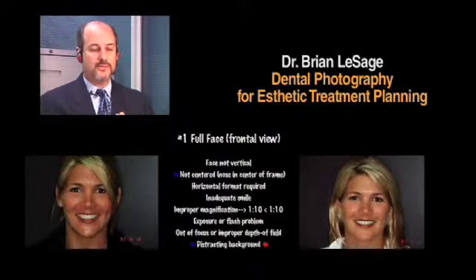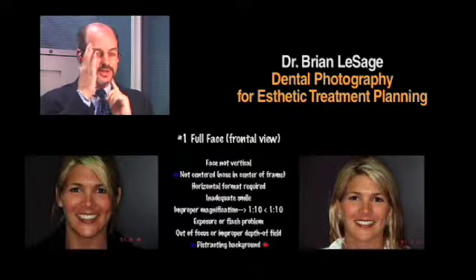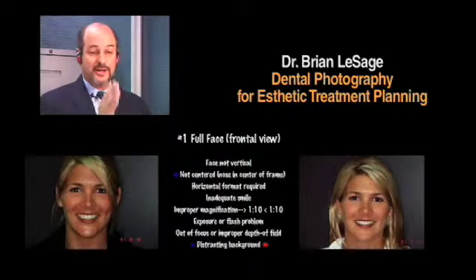Now, the camera's sitting at a funny angle, so I know it's shooting a little bit up at me, so I won't be able to demonstrate it exactly, but kind of just have them shrug their shoulders a little bit. Try to look straight forward. Again, women tend to do this, just upright their head a little bit, and men do this and just tip them down.